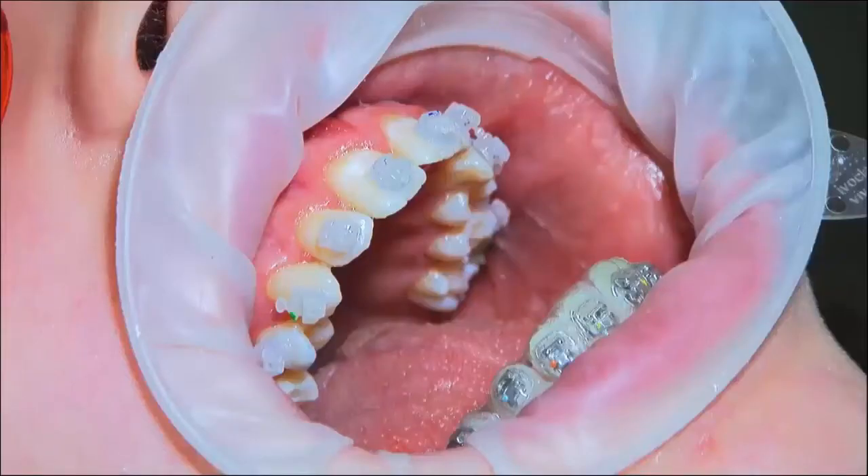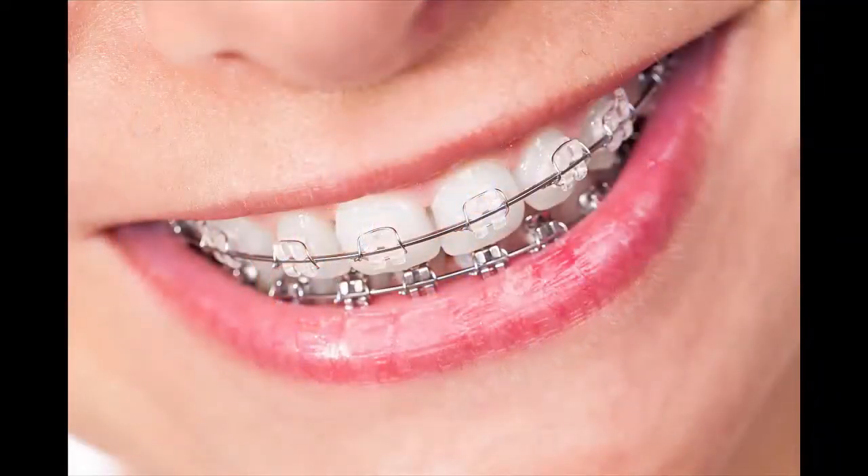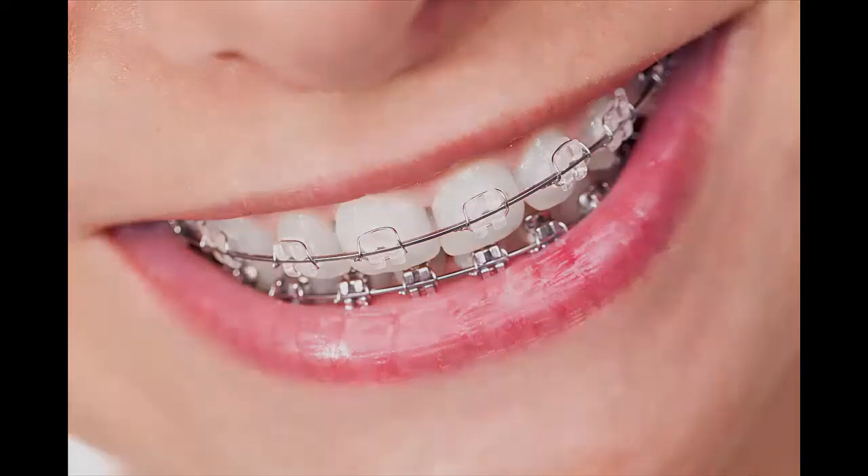It is always recommended to bracket both arches at the same session. If, however, the upper and lower arches are bonded separately, use a retainer when the gap between the placement appointments is more than 2 weeks.